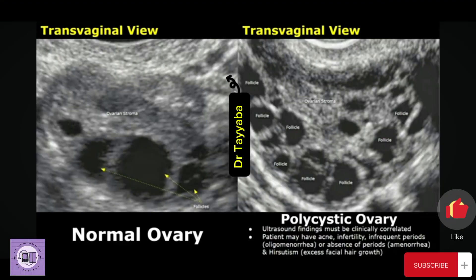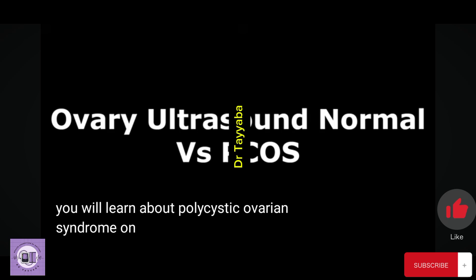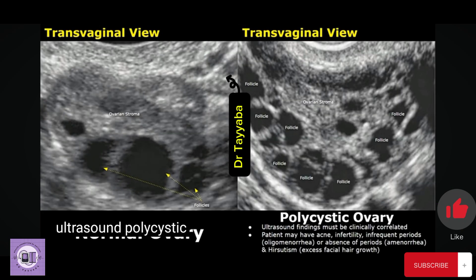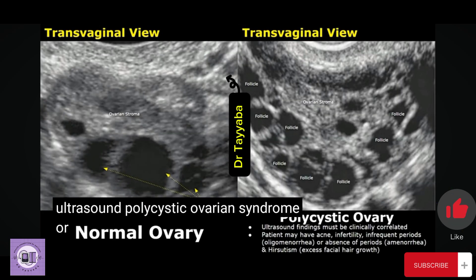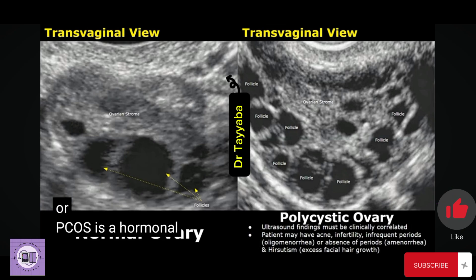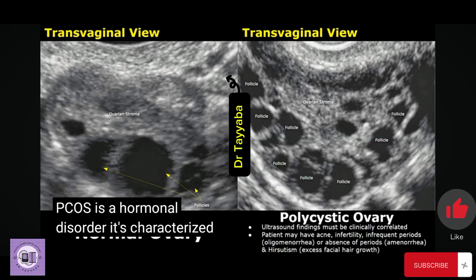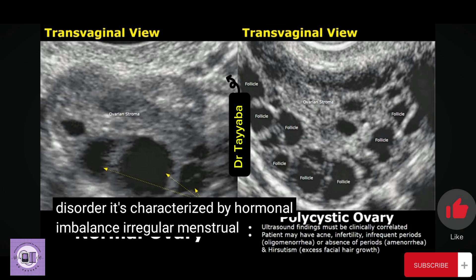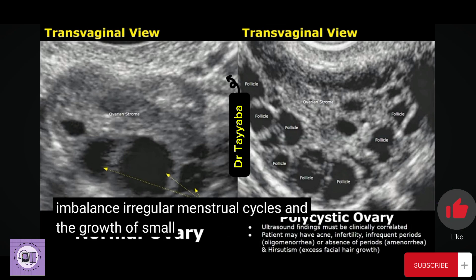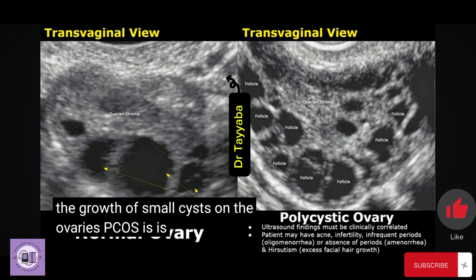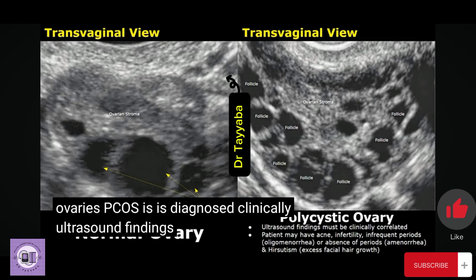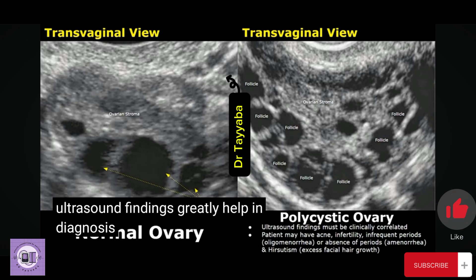Hello everyone, it's Dr. Teepa, and today we will learn about polycystic ovarian syndrome on ultrasound. Polycystic ovarian syndrome, or PCOS, is a hormonal disorder characterized by hormonal imbalance, irregular menstrual cycles, and the growth of small cysts on the ovaries. PCOS is diagnosed clinically, but ultrasound findings greatly help in diagnosing it.